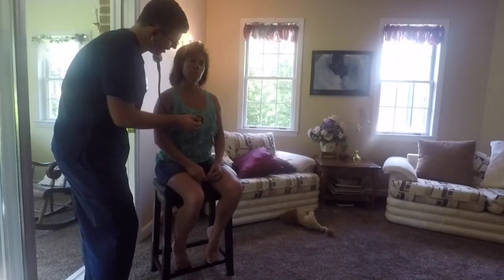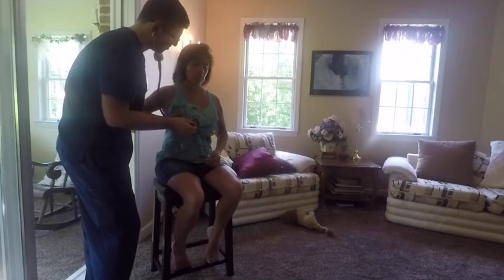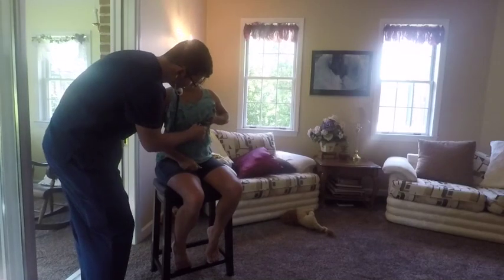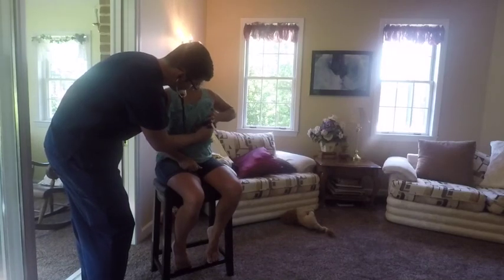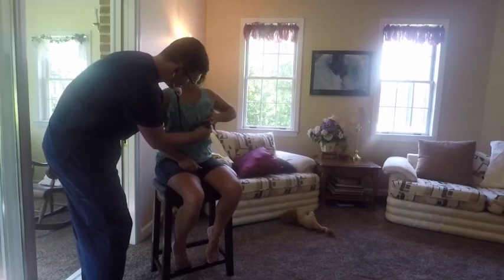Okay, and now if I can just have you lift up your left breast for me here. I'm just going to try to listen to the fifth intercostal space, left sternal border. This is where you hear the tricuspid valve. And then I'm going to move over to the PMI. This is the fifth intercostal space, and this is in the left midclavicular line.